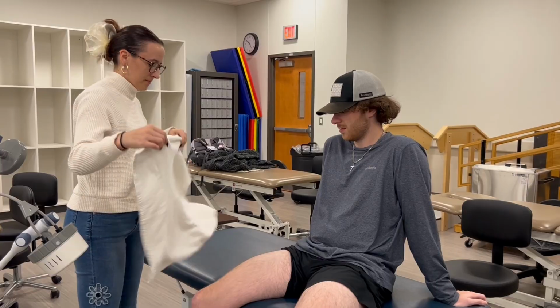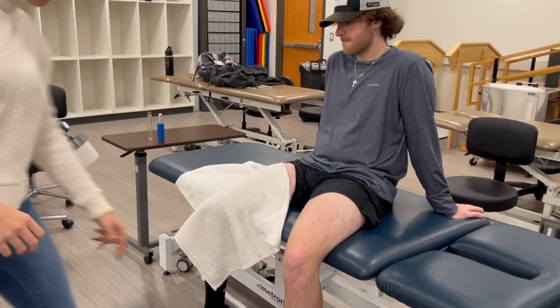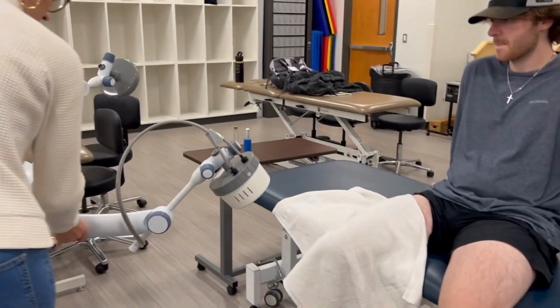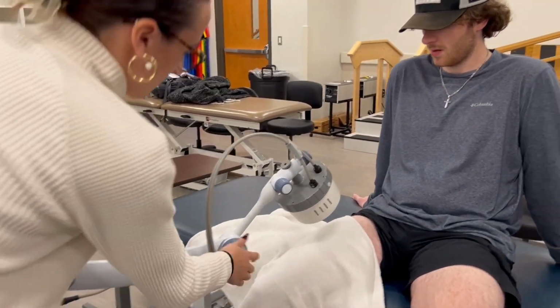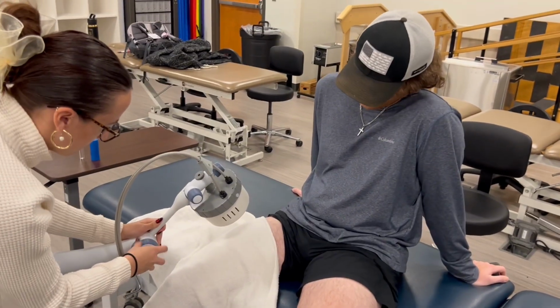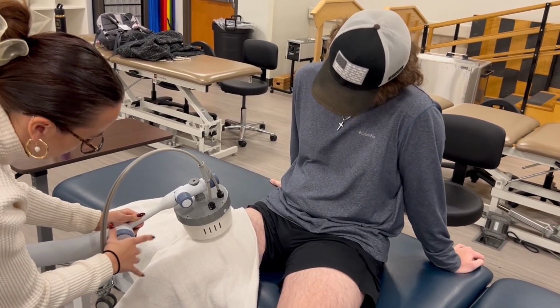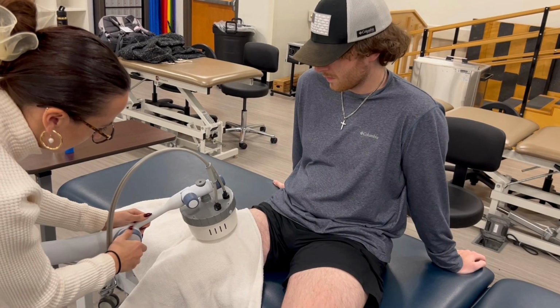Specific precautions of using short-wave diathermy on a patient are if they have an IUD with copper, using it over growing epiphysis in children, obese patients, near other electrical medical devices, and low back pain of women who may be menstruating. Contraindications include using it when any metallic objects are in the field or embedded in the body, pacemakers, pregnancy, using it over joints/organs, and using it over synthetic materials.